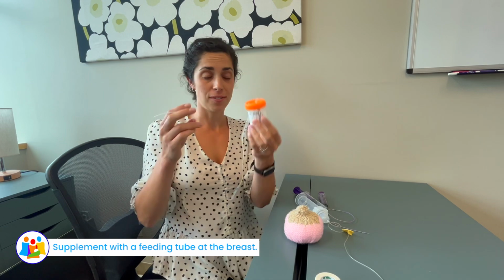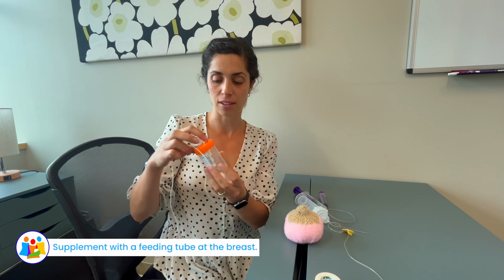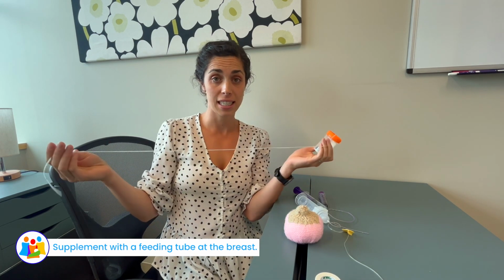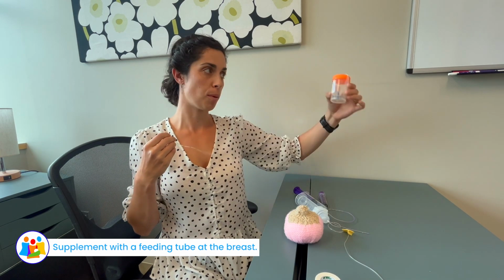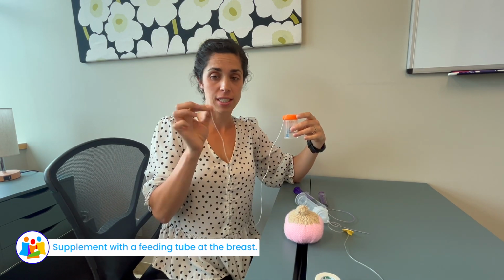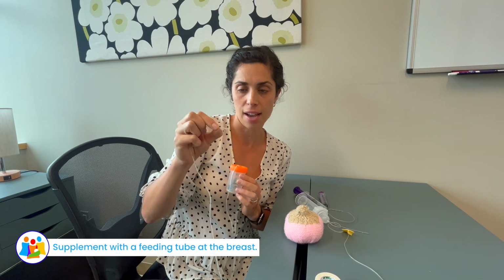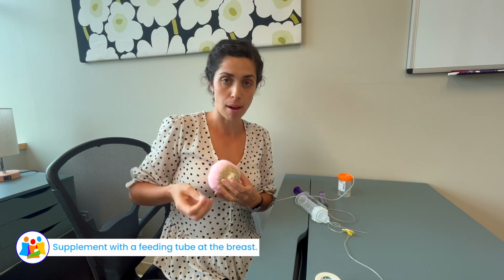I prefer the do-it-yourself version, where I use a food grade plastic canister where the milk is poured, and it just has to be enough to cover the cap at the bottom. This is a 36-inch length, 5 French diameter tube, which has more width for moms to be able to place it where they so wish. I also carry the 6 French diameter tubes because some babies like the flow that's a bit faster from that. This style has 3 little holes on the end that have to be inserted enough into the baby's mouth to have suction around them. And moms do this in different ways.